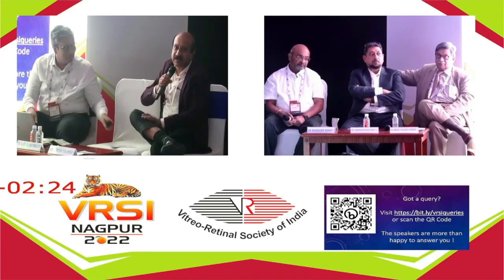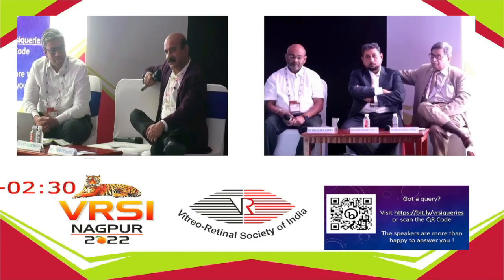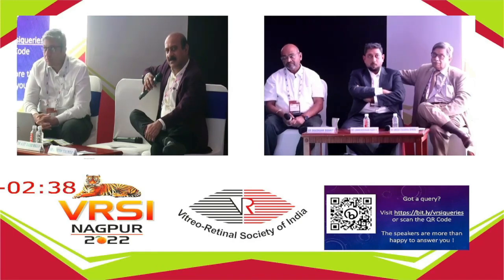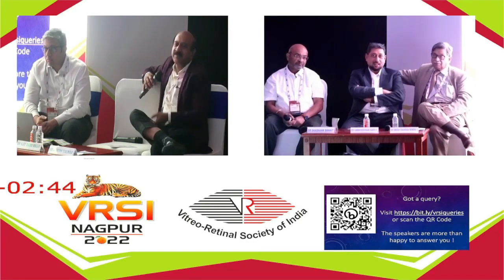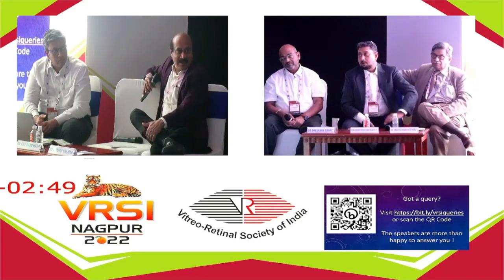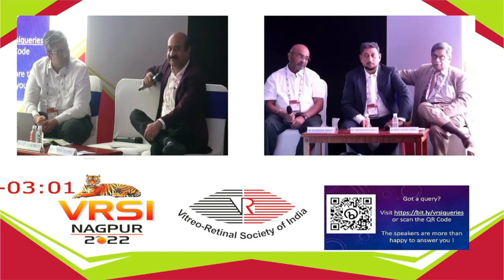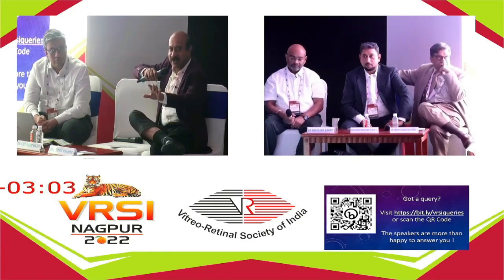The entirety of intermediate CNVM that one picks up with the OCTA is far better as compared to the fluorescein dye. While looking at the overall use of ICG as compared to OCTA for the choroidal lesions, more or less it has in some way replaced it. You need not use ICG angiography in most of the cases. OCTA does the job for you. For CSR, if you're using the swept source OCTA, in most of the cases when the blood flow is optimal at the time you are doing the scanning, it more often than not picks up the CSR lesion. I would say 6 to 7 out of 10, not 10 out of 10 CSR cases. Yeah, that is the problem where we are limited with OCTA at the moment.